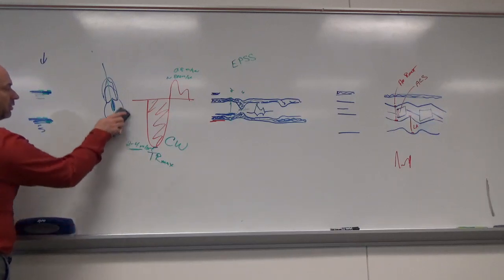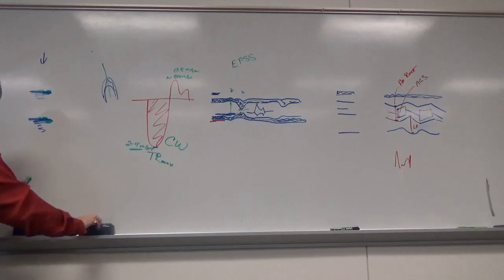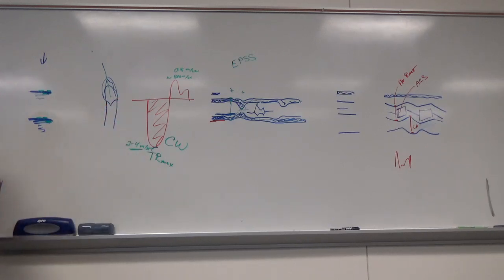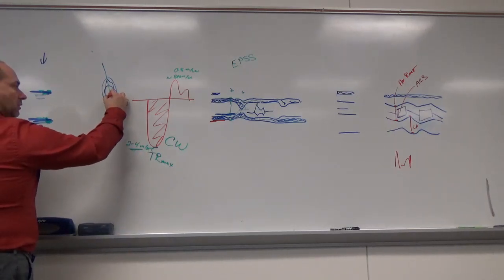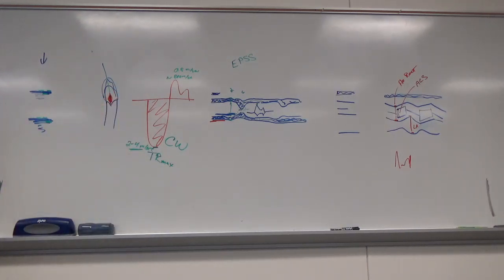Let's do pulmonary valve next. So that's all we need through that valve. Pulmonary valve, again, points away from the transducer, or away from the ventricle. The leaks on this valve, again, pulmonary stenosis is also rare, so we don't look at that often, but we do take Dopplers through it fairly regularly. You're going to get what's called a candle flame, so it looks like a little candle. On a regurgitation, it's going to be red, because now it's coming towards my transducer.